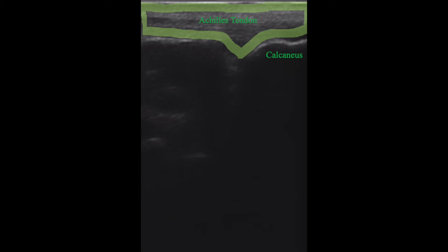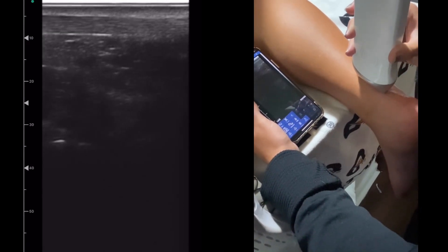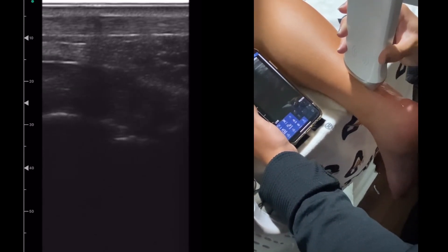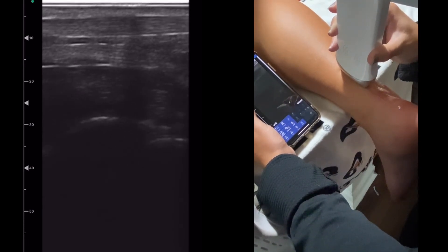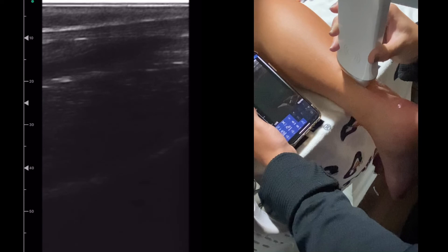This frozen ultrasound image shows the Achilles tendon outlined in green. The hyperechoic line on the right side of the picture is the calcaneus, where the tendon inserts. It is best for the clinician to find the hyperechoic line of the calcaneus and move the transducer notch proximally from that point. The fibrillar band just superior to the calcaneus is the Achilles tendon. This video follows the tendon proximally to the triceps surae complex.